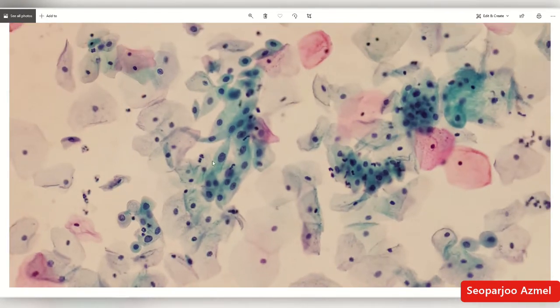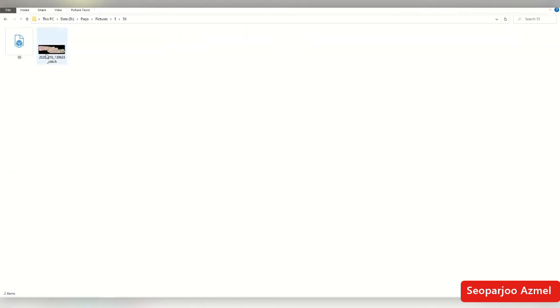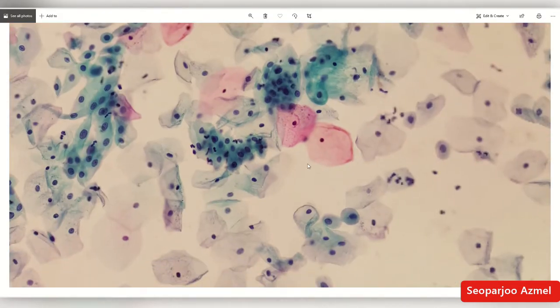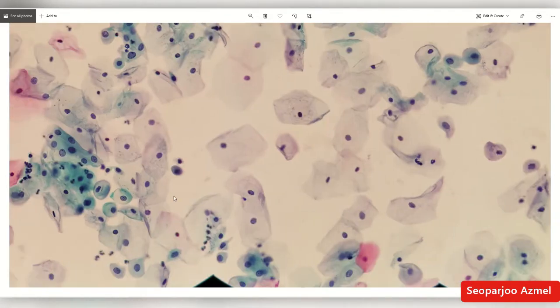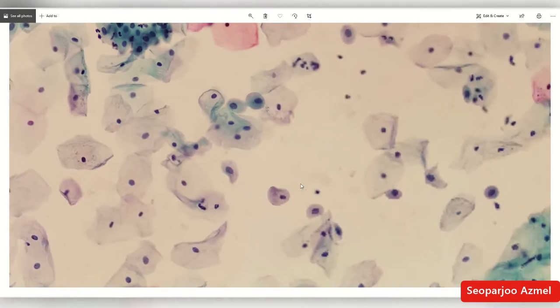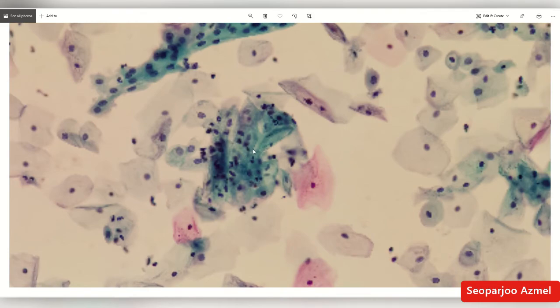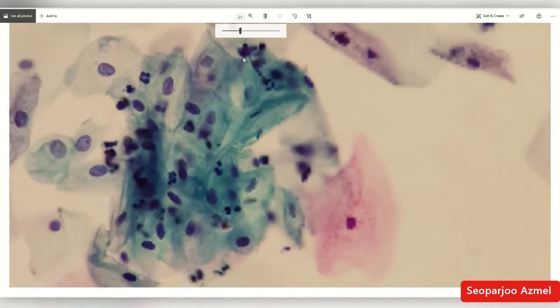But you can see that the image becomes a little pixelated or blurry, because this is a big image. If you want to know the size of the image, it is around 159 megabytes. So that's a big image, and if your computer has a good graphics card, good RAM, and good processing power, then most probably this pixelation becomes less evident, and it becomes sharpened faster. You can see it takes some time for the image to become sharp, because my computer is a bit old and cranky and has a lot of problems.